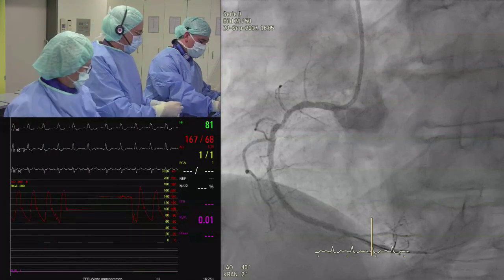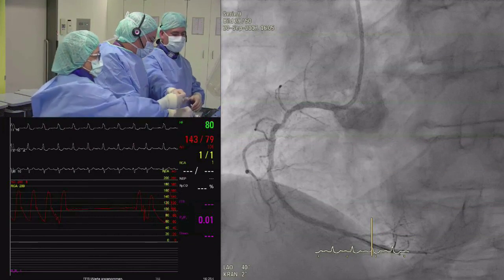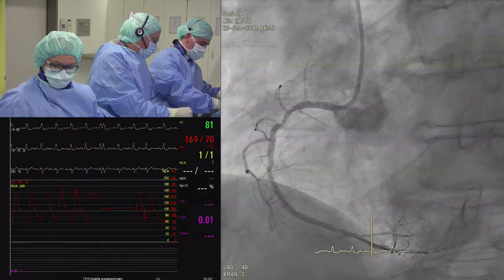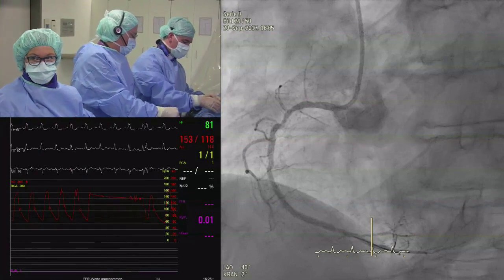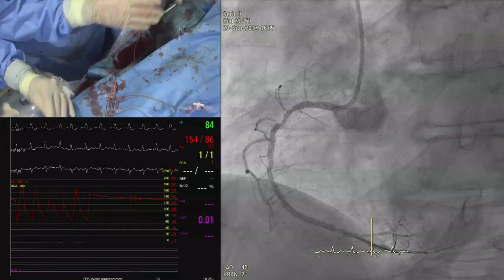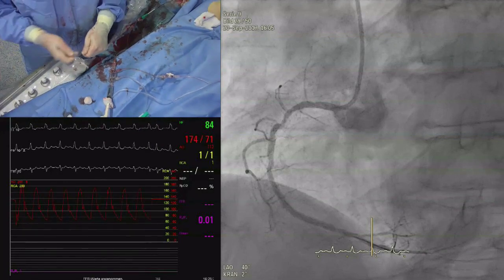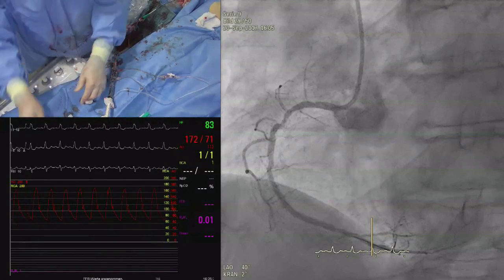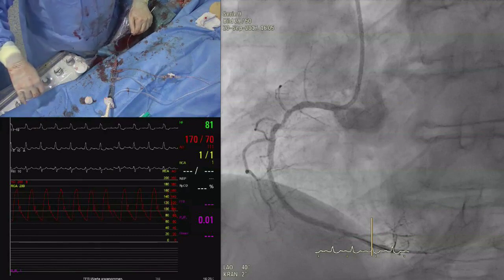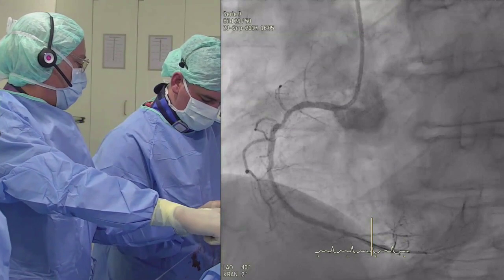Okay. So we have a rather big CTO program. Let's do a show of hands in the audience. How many people routinely check an ACT? Just a few. And how many just go with the bolus and just rely on whatever it is? The audience here is divided, checking ACT versus not checking ACT.